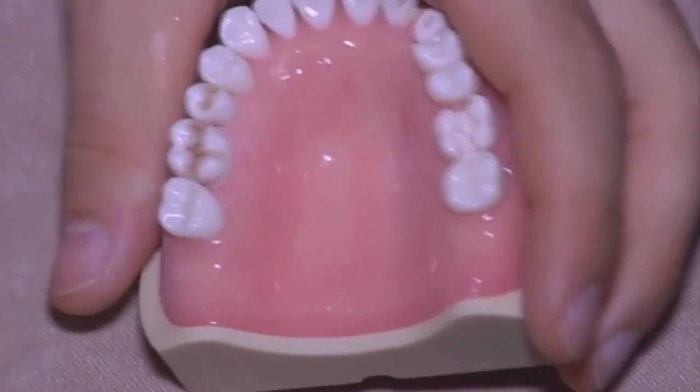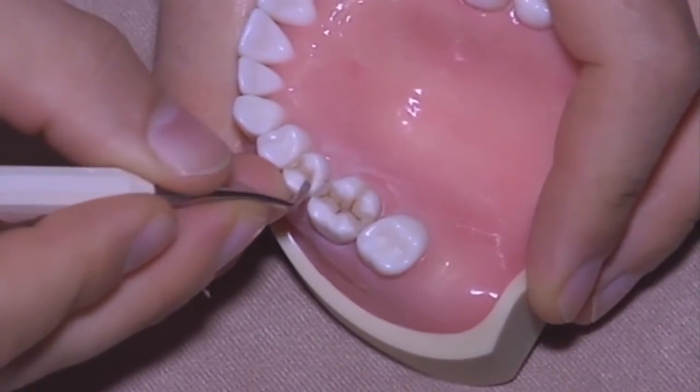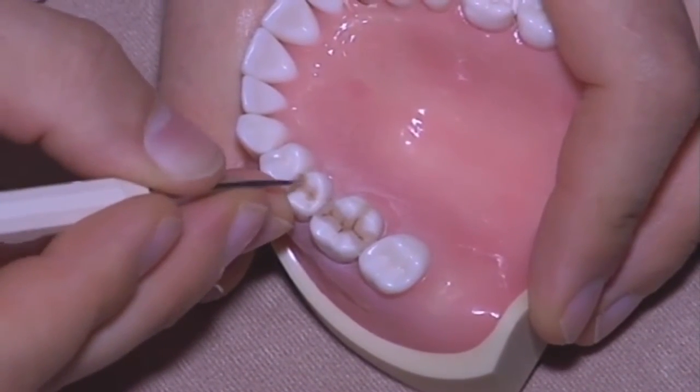Here we are. So this is a simple step-by-step procedure to perform 2 restorations or 1 restoration.